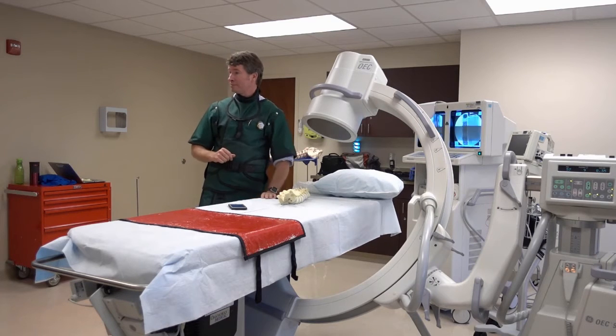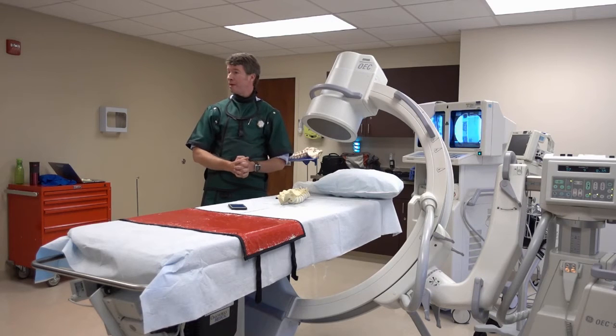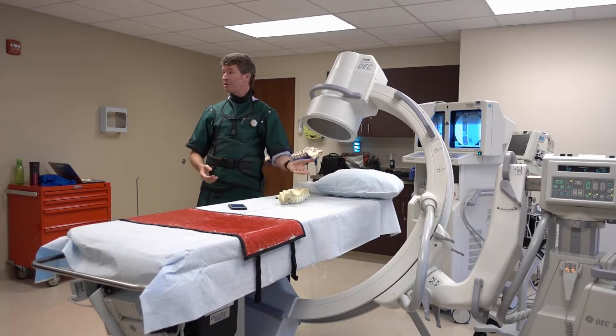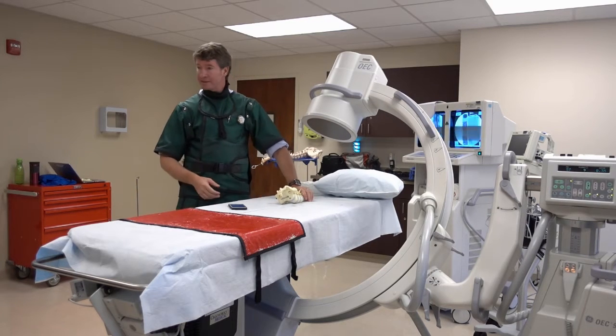Next, protect the patient, right? What I mean by that is cone, okay? And cone a lot. The more coning, the less radiation the patient gets. They're the other person that's going to get radiation. That's really important. Lastly, protect the staff.